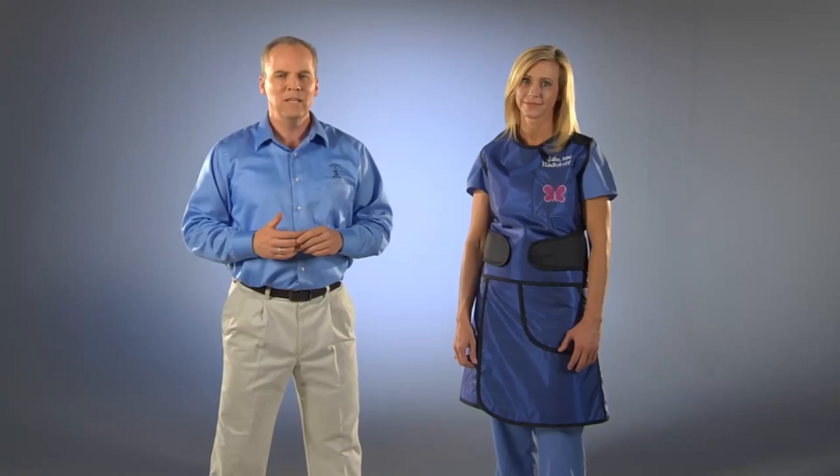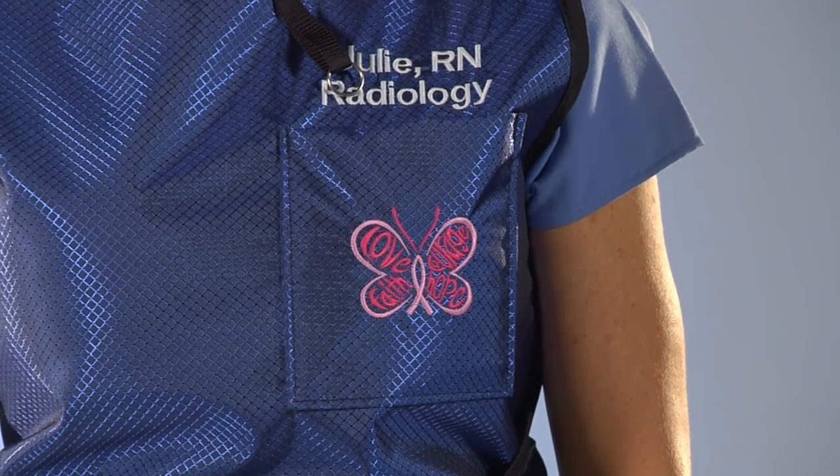Like all of our premium aprons, the PVK is available in our lightweight lead-free Viralite as well as reduced weight Burlite and regular lead. Protective levels offered are 0.5mm, 0.35mm, and 0.25mm lead equivalency.